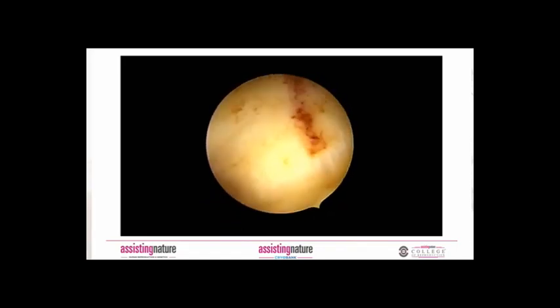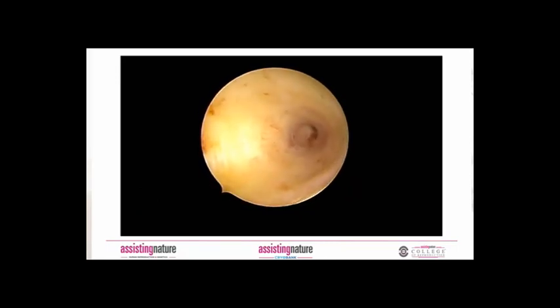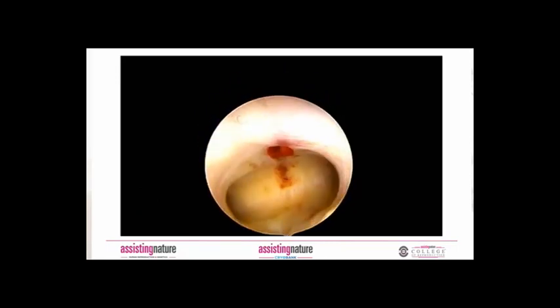As you can see here in the video, we are preparing to perform the FESI procedure.